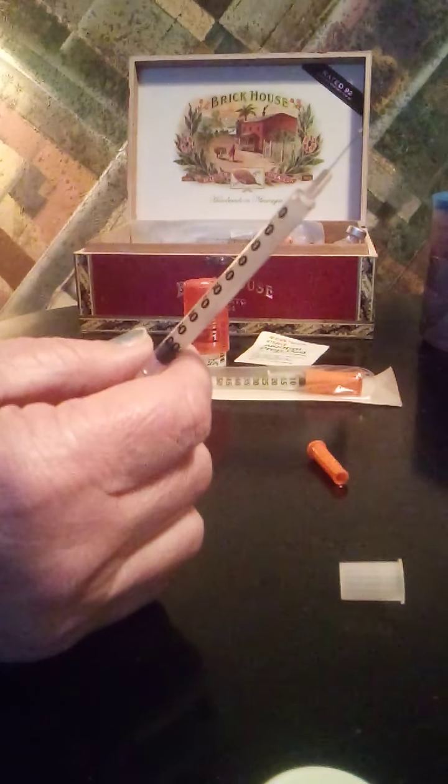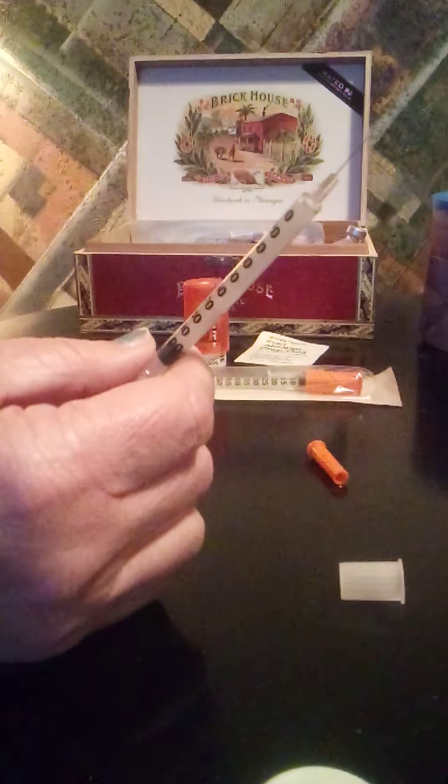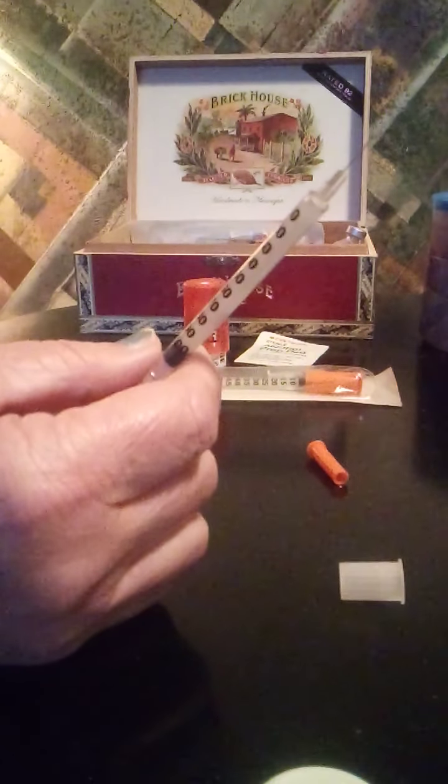Pull the syringe straight up so you don't bend the needle — it's really important you don't bend your needle. I've got a granny gown on, so I can't show you my insertion. What I do is I pinch and insert the needle about an inch and a half from my belly button. This one I'm going to do on the right side. Push it in at a 90-degree angle, pull it straight out at the same angle.